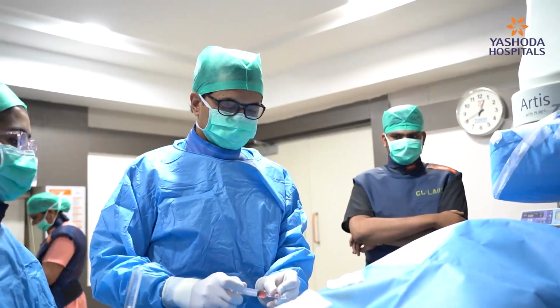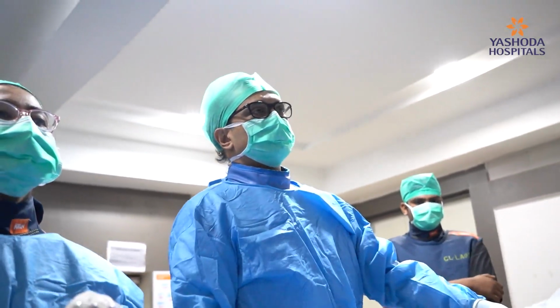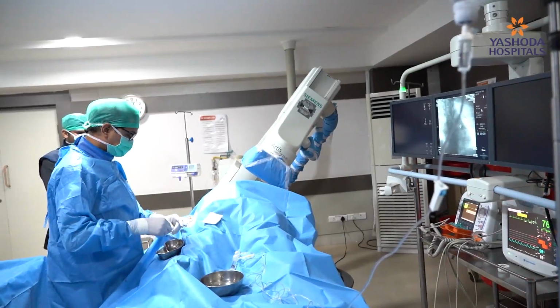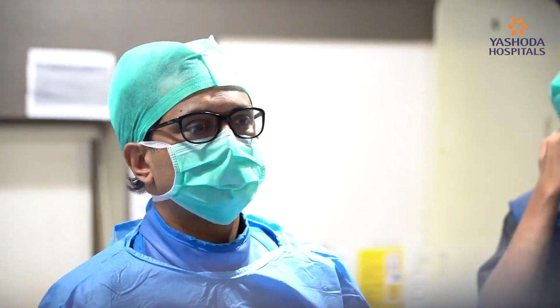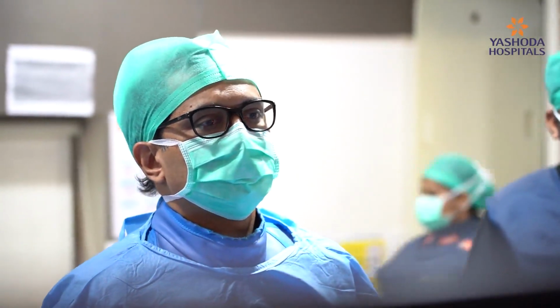Suppose a patient is below 65 years of age, and requires aortic valve replacement for a severe aortic stenosis, then for this age group, generally we will prefer a metallic valve. And metallic valve replacement can be done only by surgical means. And there's another age group, the age group above 65 years of age. In this age group, generally we prefer a bioprosthetic valve, not a metallic valve.